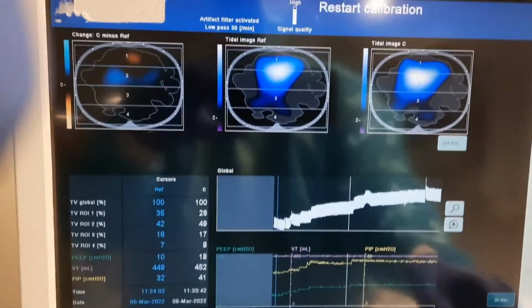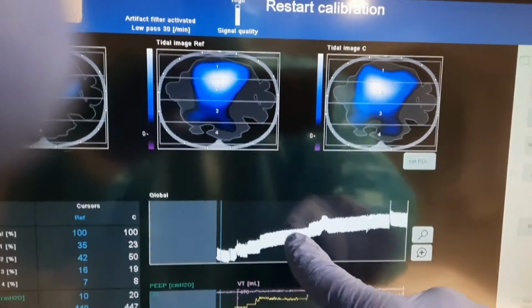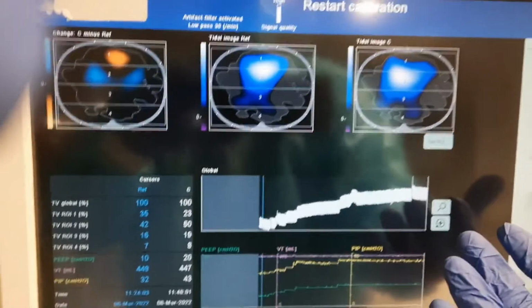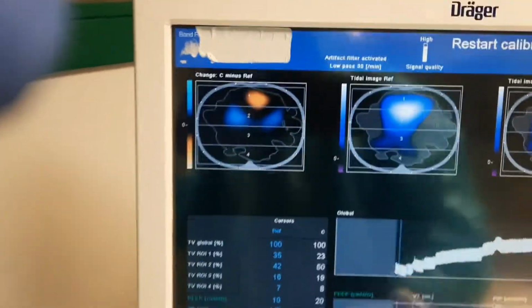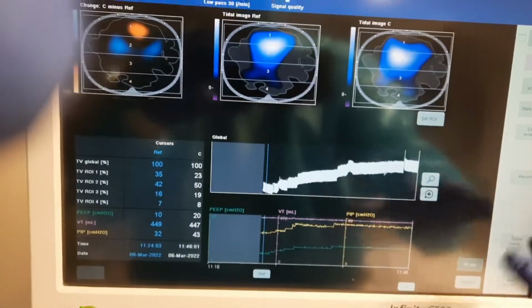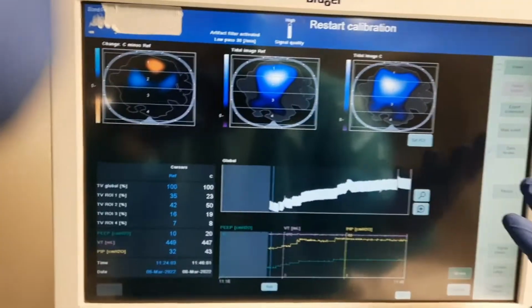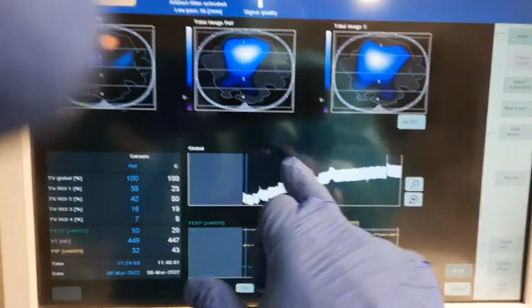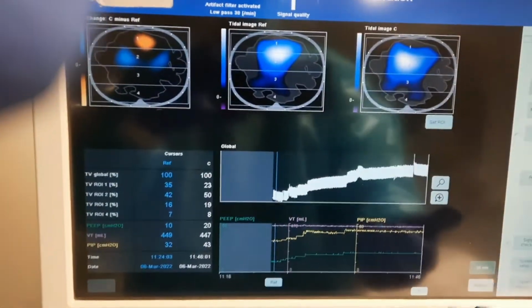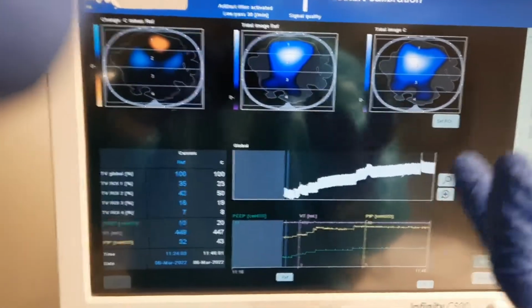up to 20 over time, and you notice here this is recruitment of functional residual capacity. This is becoming more and more air, generally over here. Okay, so as this is shifting, again, the PEEP studies should be done a couple of times as things are recruiting, maybe one at the start where you get some recruitment, and then over time when the impedance curves flatten out, it shows that there's no additional recruitment. Therefore, we should do another PEEP study before leaving. We want to do multiple times to make sure that the results are reproducible.